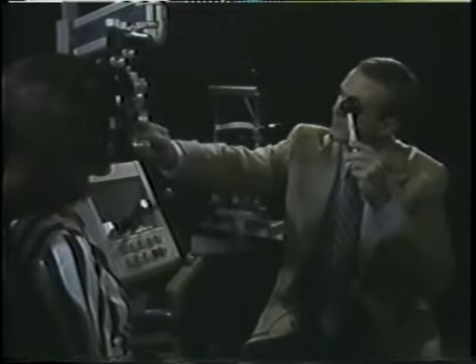Retinoscoping off-axis more than 15 degrees introduces significant unwanted astigmatism. Keep both of your eyes open if possible. It's easier to do this if the room is quite dark. The best fixation target is a small light.